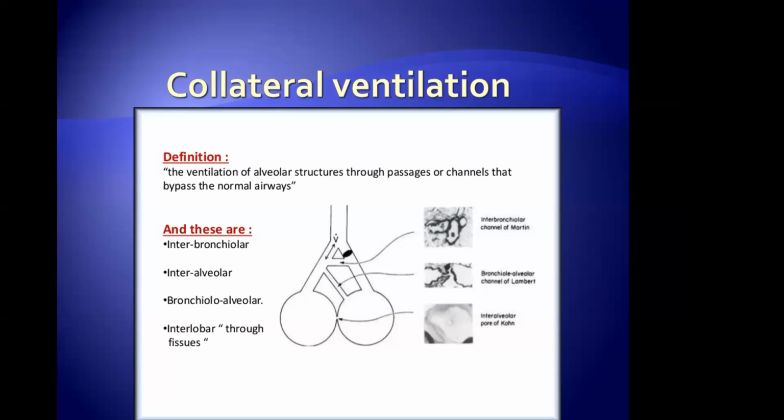So here's what it looks like graphically, but we know physiologically what it's doing because we had to learn this in school. And again, if you're a nerd like I am, you visualize that. So as you're articulating your care plan, you're saying, okay, I need to get more alveoli recruited. If you have a family practice physician that is managing your ventilator and they say, well, give them a PEEP of 5. Well, what's that going to do? Nothing. So let's give them a PEEP of 10.